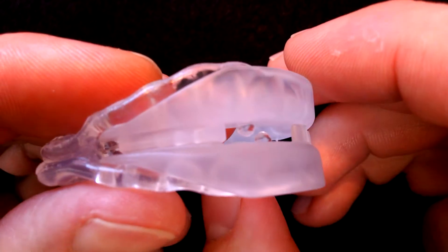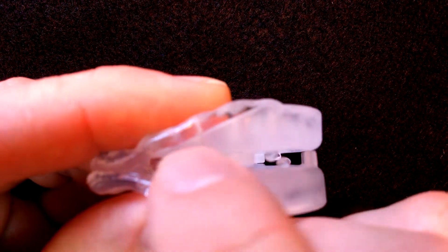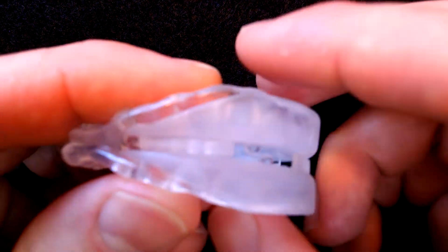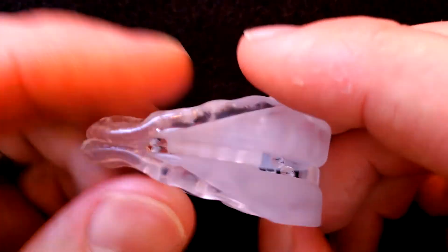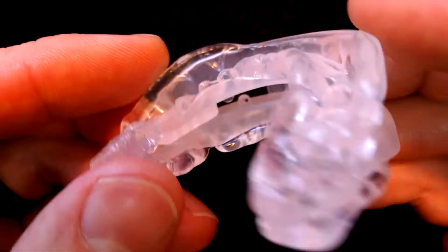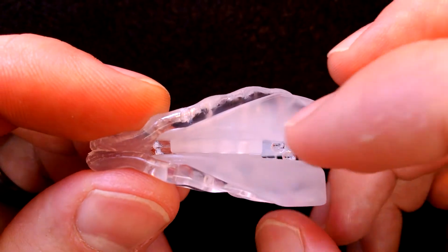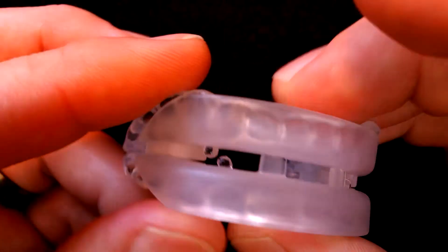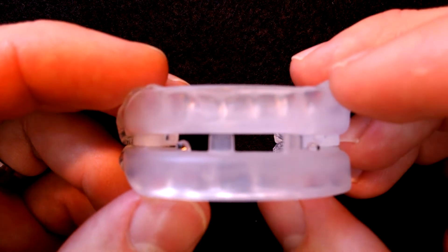This is the PureSleep, it's a mandibular advancement device. When you receive this, it's going to have four holes in one tray and then two pins in the other. You're going to set the pins in the appropriate slot to create the advancement that you desire. You're going to heat it up, bite down, take an impression of your teeth, and it's actually going to fuse these two pieces together. The PureSleep has a hard plastic frame with a soft thermoplastic lining in either tray, and it has a large air slot at the front. PureSleep you're looking at paying about $60 plus $10 shipping, so about $70.